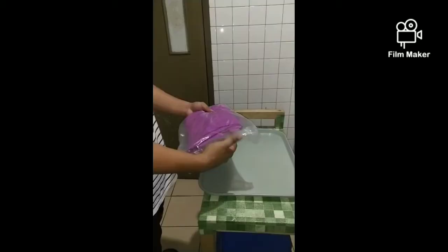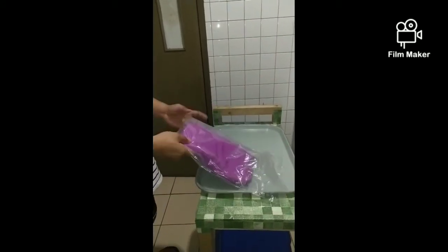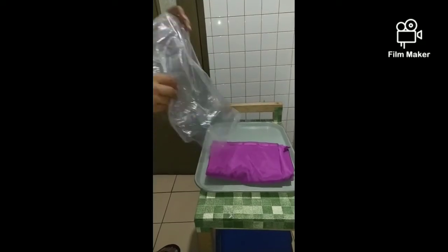Hi, I am Sheena Dela Cruz and I'm going to perform donning of sterile gown and gloves. During the hand washing procedure, check hands and fingers for cuts, abrasions, or areas of inflammation. This is to prevent cross-contamination of microorganisms in the sterile equipment. Let the circulating nurse prepare the gown and gloves.